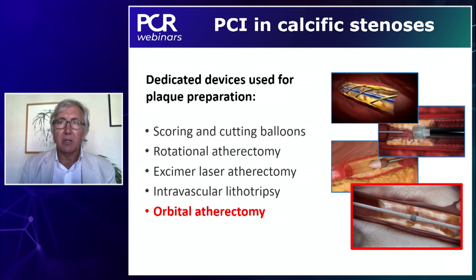We have put together a session today to discuss with you a new technique, orbital atherectomy, a technique that has joined the portfolio of techniques we have on our shelves to treat calcific stenosis during PCI. Orbital atherectomy has been available to American colleagues for years, but now in Europe and other parts of the world, we have the opportunity to bring this to treat our patients.